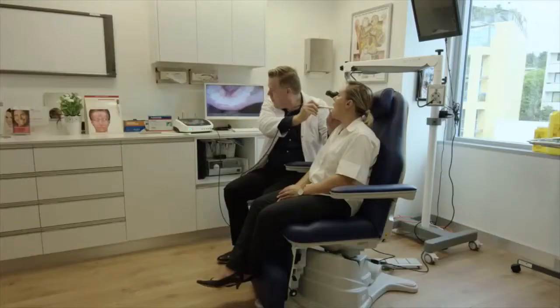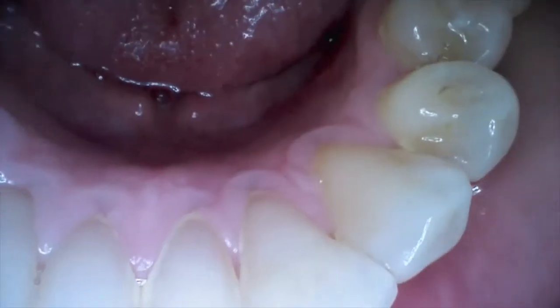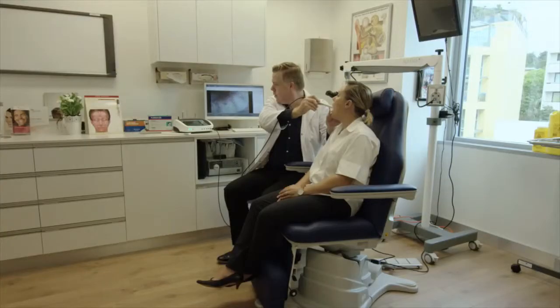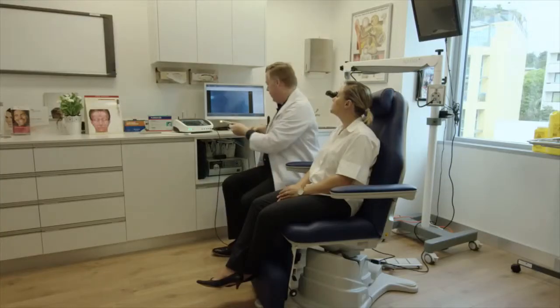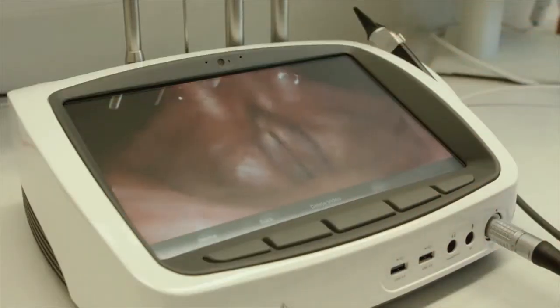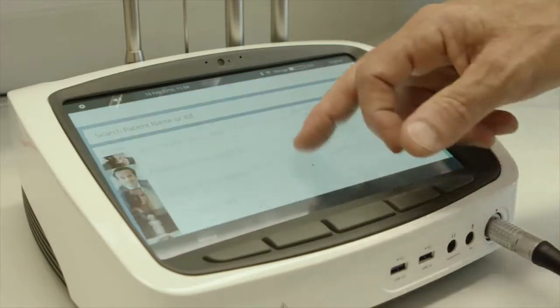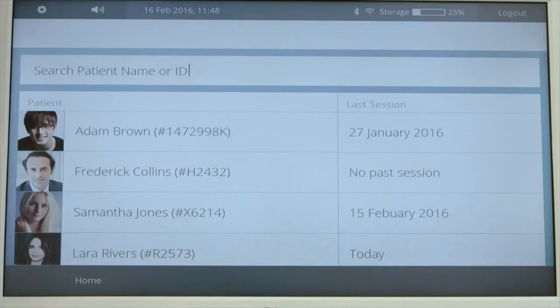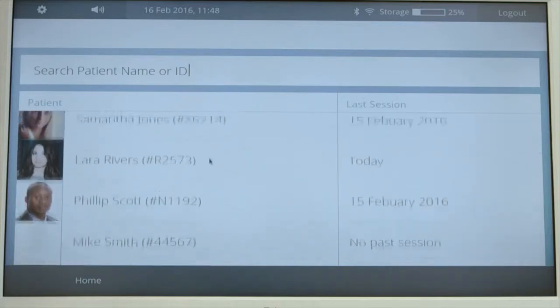Video conferencing can be used in a live feed with the patient exam being transmitted in real-time to the specialist, or using store and forward technology where previously recorded videos are played back to the specialist through the VC connection at a later date. All images and videos are stored locally under the patient file and against patient sessions for ease of retrieval at a later date.